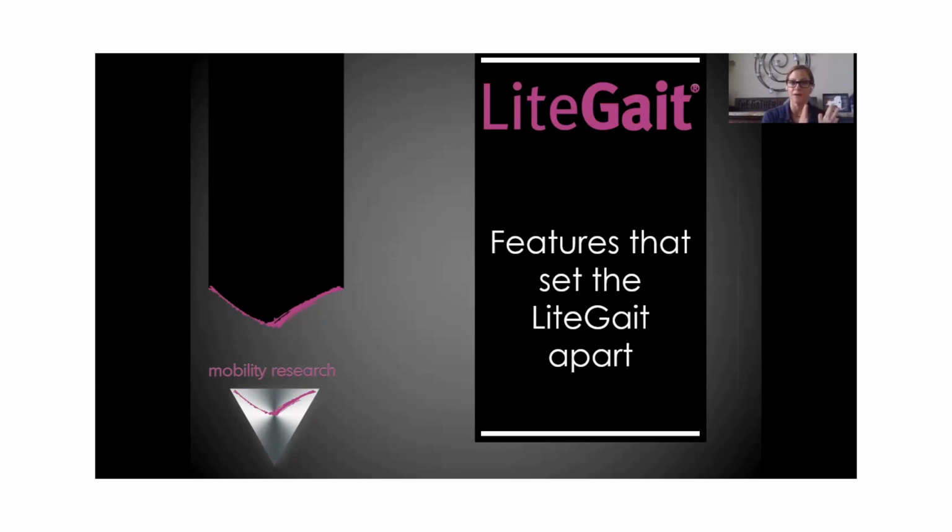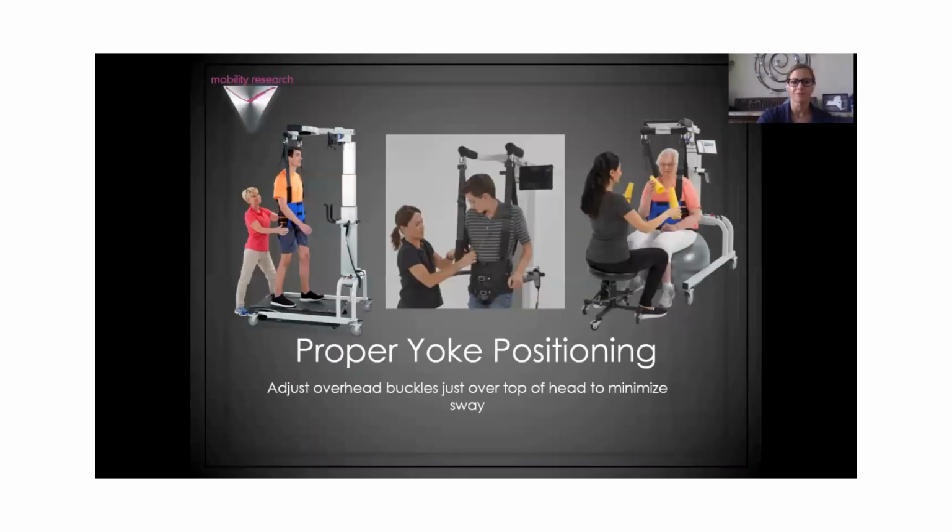So we can have very rigid support that does not allow a lot of excess movement for the lower functioning patient who really needs to hone in on what they're working on, to just free movement, no restrictions. It's just kind of there as a safety net for some of our higher functioning clients. And so we'll talk about some of those features.